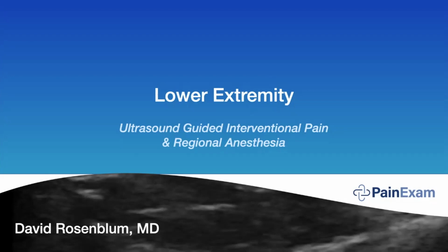And the last question, for frozen shoulder, no PRP, someone's asking. I would use PRP in any inflammatory condition, pretty much. Have I used PRP? I've done plenty of shoulder PRP. For frozen shoulder, though, my first go-to block would probably be the suprascapular with local. Because if it's something that can be just treated with physical therapy, you may not need the PRP. But if it's a chronic inflammation, PRP probably would help, even if it's regular frozen shoulder.